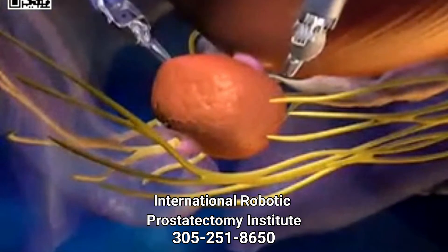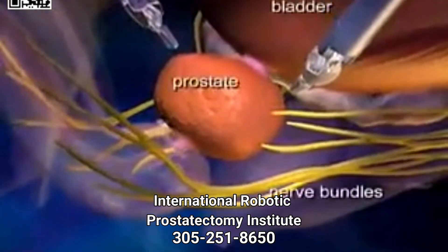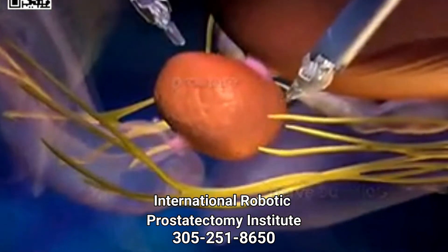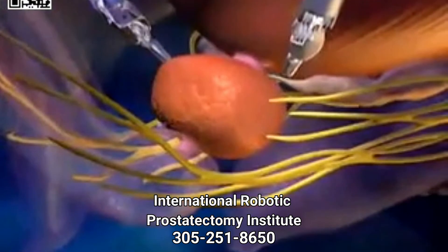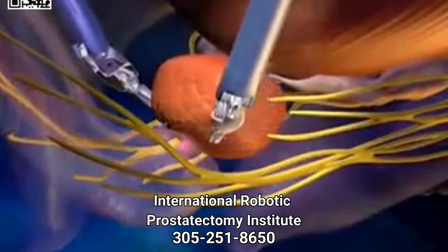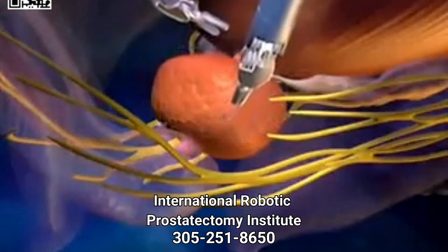Looking inside the pelvis, the anatomy around the prostate consists of muscles and delicate nerves that affect both urination and erections. During the removal of the cancerous prostate, your surgeon works to spare these very delicate structures utilizing the articulating da Vinci instruments and a highly magnified 3D view of the anatomy provided by the system.